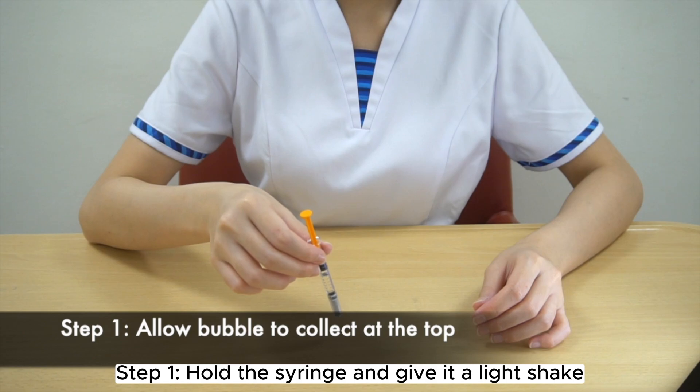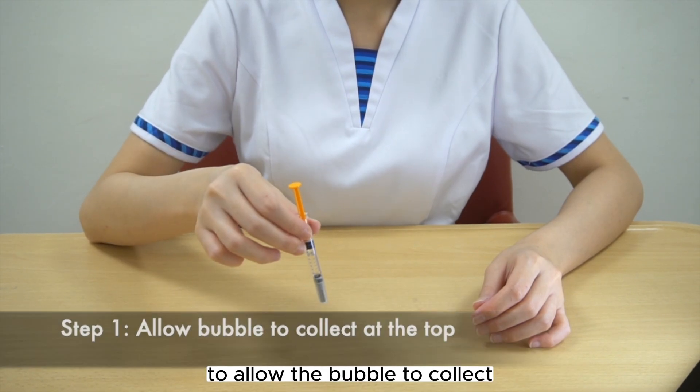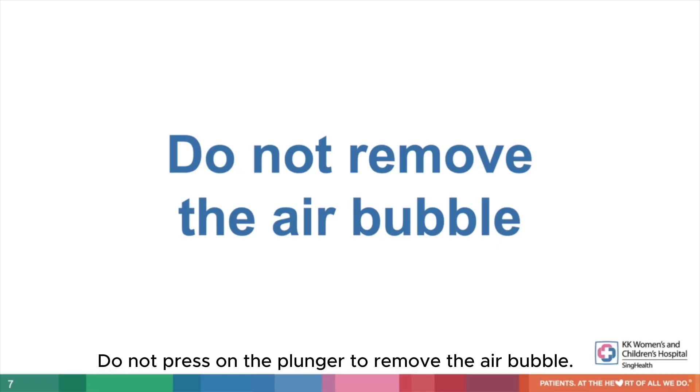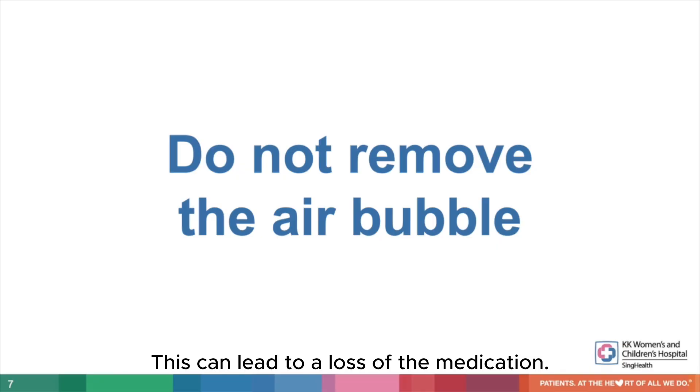Step 1. Hold the syringe and give it a light shake to allow the bubble to collect at the top of the syringe. Do not press on the plunger to remove the air bubble, as this can lead to a loss of medication.